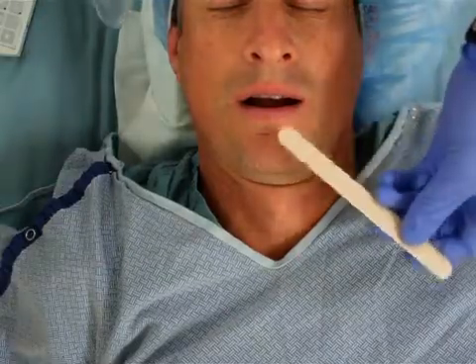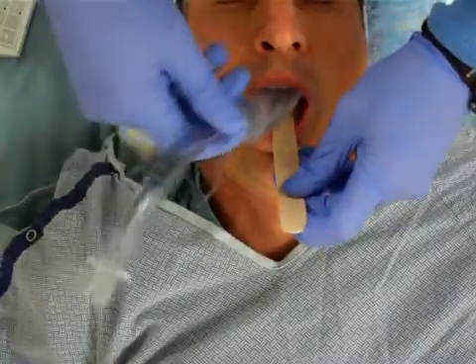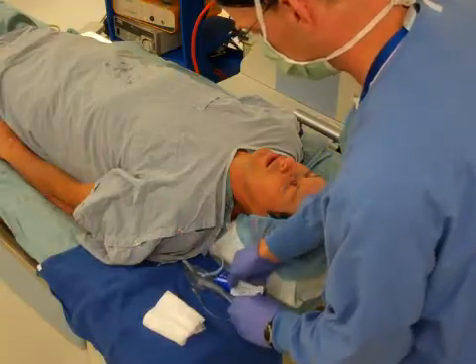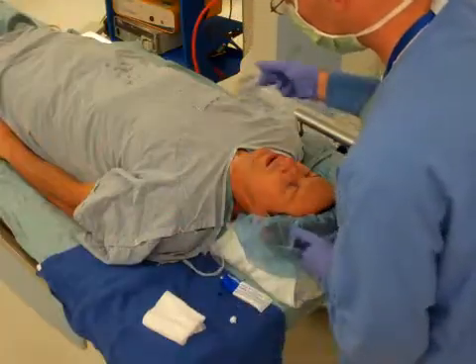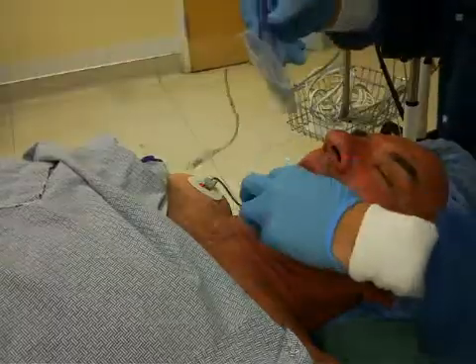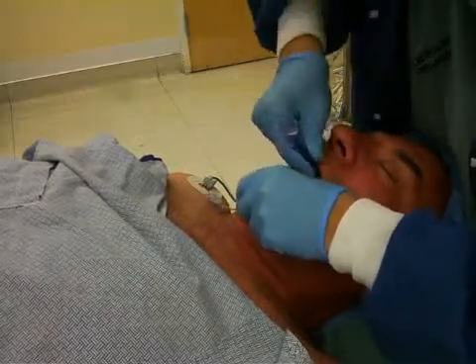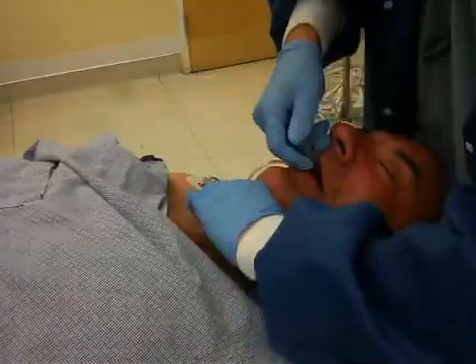Use of a tongue blade to partially retract the tongue and provide counter pressure against the hard palate is one way to improve entry of the laryngeal mask airway into the mouth. Additional lubrication or briefly dipping the cuff in clean water may also help prevent the cuff from sticking to the tongue and oropharynx. A small mouth opening or large tongue may prevent use of the operator's finger and hand to get the LMA behind the tongue; in such cases, use of the connecting tube shaft to create downward pressure may be necessary.